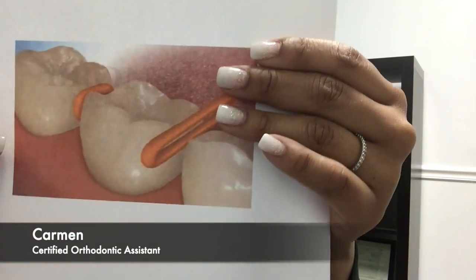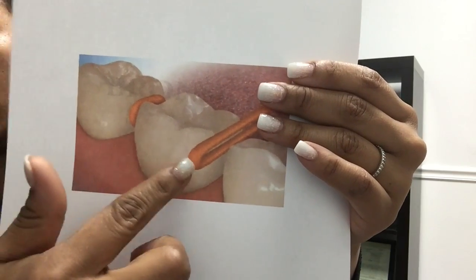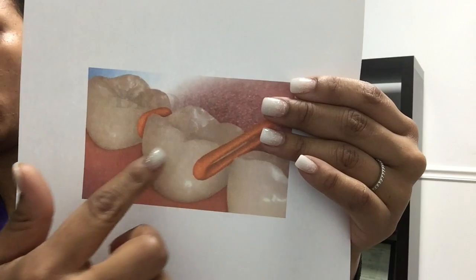Good morning everyone, my name is Carmen from Straighten Out Orthodontics. Today we're going to cover what separators are. Separators are small rubber bands that get placed in between your teeth, usually in the back molars, to help make room for the metal bands.